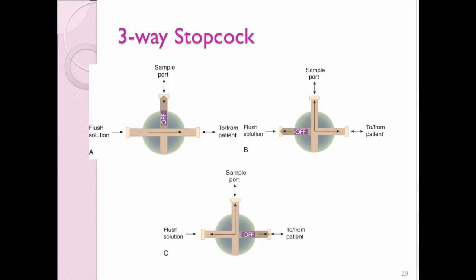There's a little valve over on the bedside that says arterial on it, and you open that valve, and it'll flush the blood back into the patient. All you have to do is clean the line. You don't have to flush a whole bunch in there. Just make sure there's no blood left in the line, because if there is, it's going to clot.